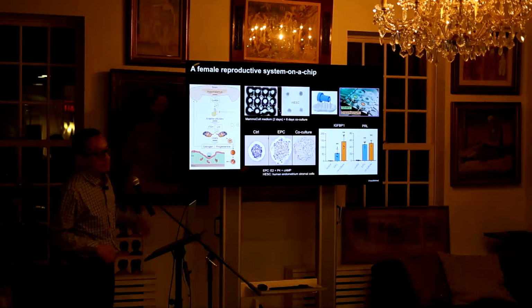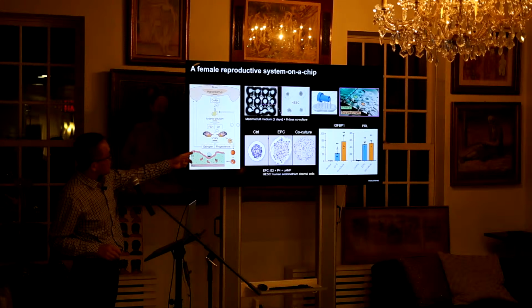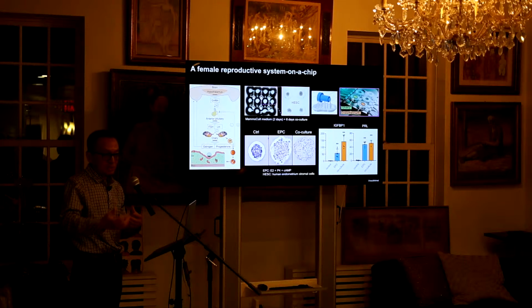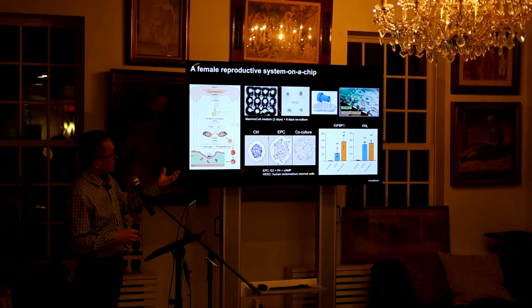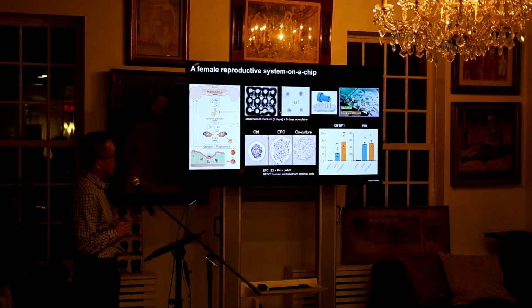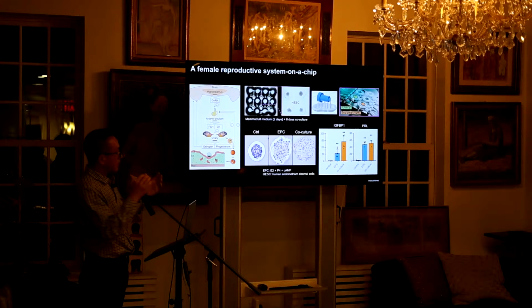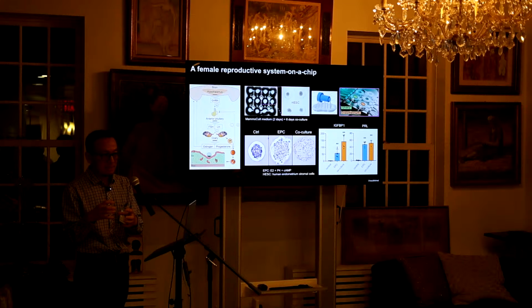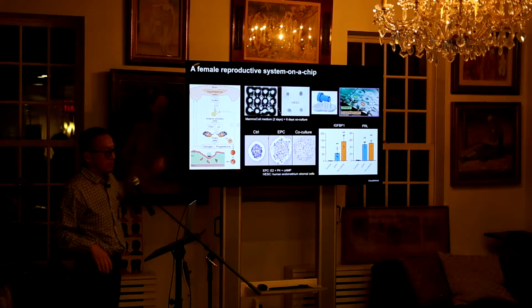So we just use the same idea, a hydrogel encapsulation method, but we collect the human endometrial and stroma cells, which compared to the ovary is relatively easy. We still do the 3D culture, and we want to induce the decidualization process to mimic the uterine receptivity and the embryo implantation. Overall, the answer is yes. We can use estradiol, cyclic AMP, and also progesterone, EPC, which is very well accepted in the field. You can get a lot of papers using EPC.